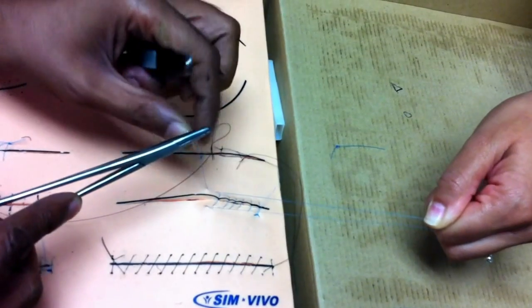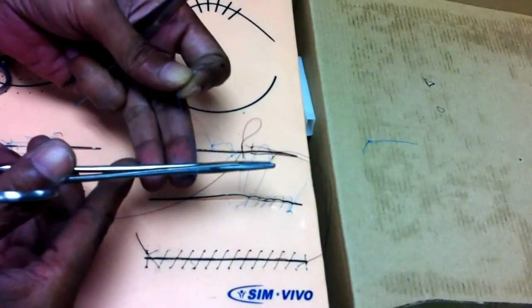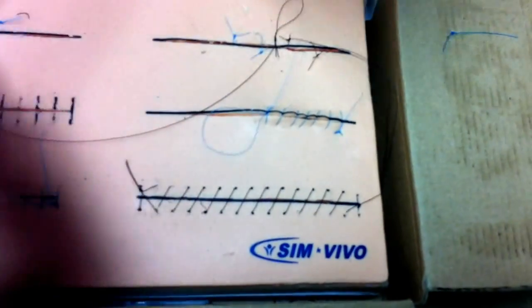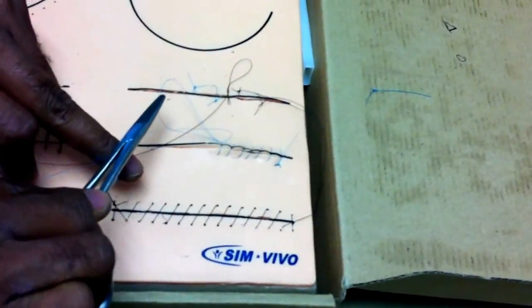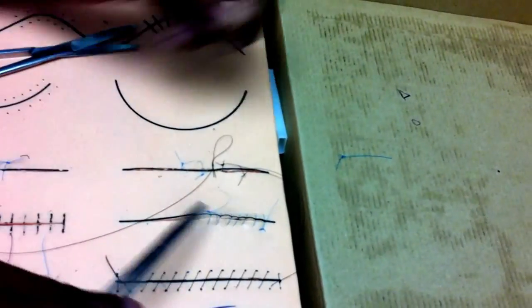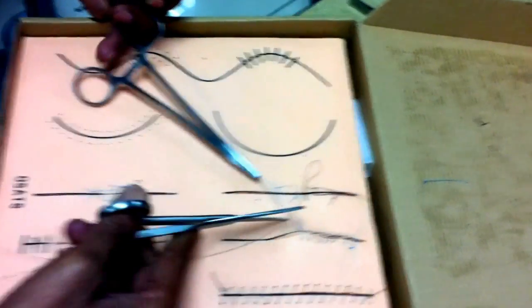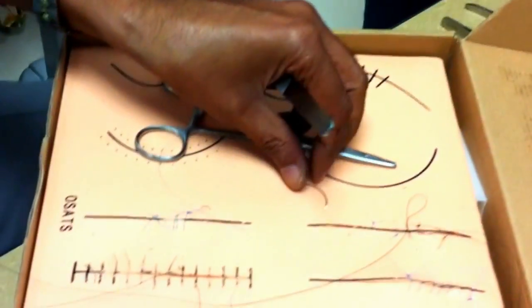Suppose you've decided to stop here. Once I've taken this, I'm going to leave a little bit of a loop here like this. And then I'm going to take a double, and I'm going to catch hold of the middle of the loop. Did you see how I made the knot? Then again, now I'm going to do the reverse. Make sure the knot is always on one side. It should not be on the suture line. That'll give a painful scar. I'm putting multiple throws because from my experience I've seen that nylon tends to slip. So I always prefer to. And then finally, once you've done, you just cut it off. So this is continuous non-locking suturing in the skin.